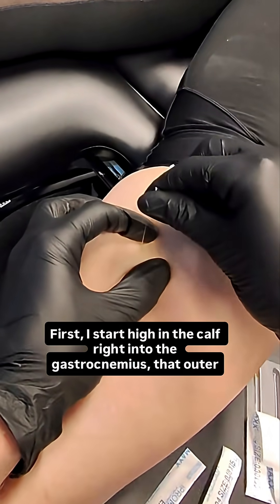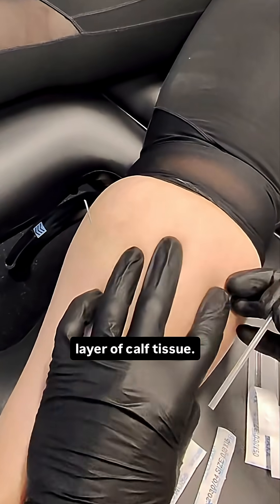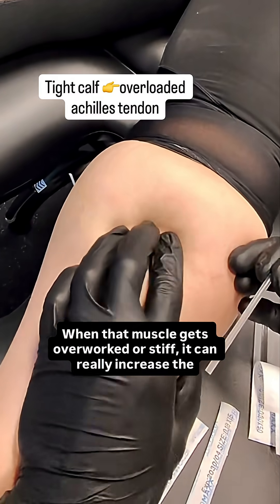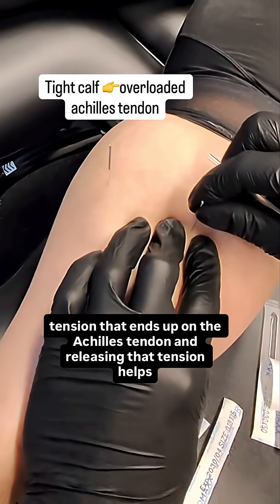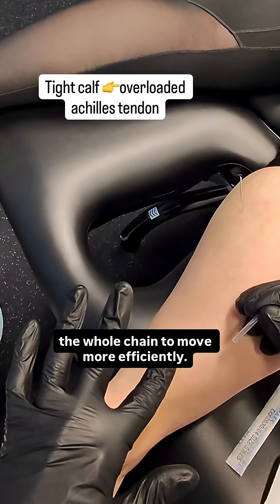First, I start high in the calf right into the gastrocnemius — that outer layer of calf tissue. When that muscle gets overworked or stiff, it can really increase the tension that ends up on the Achilles tendon. And releasing that tension helps the whole chain to move more efficiently.